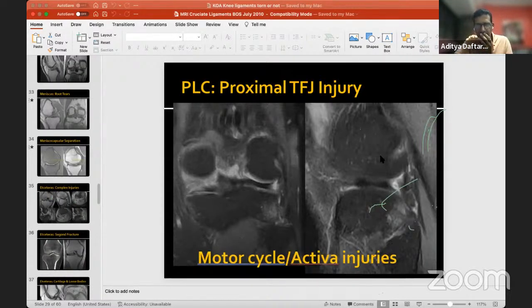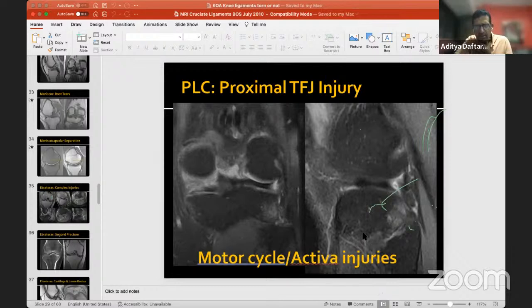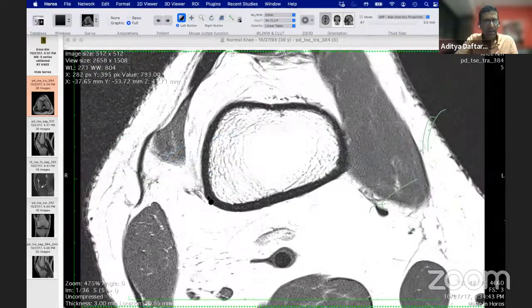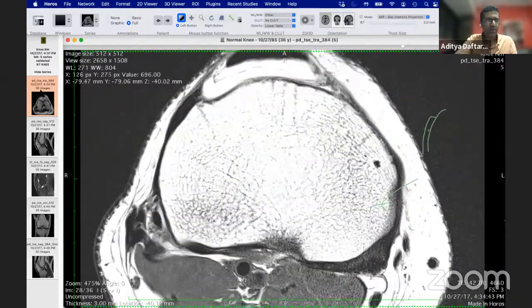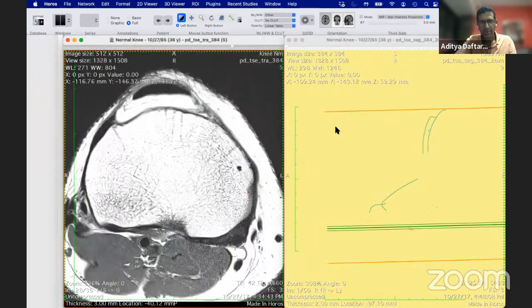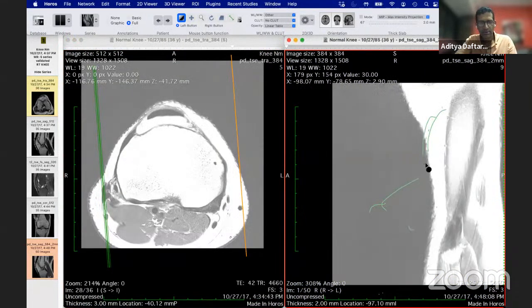Yeah, there will be. I think the next session is only a week later. Sometimes they will differentiate normal PCL and meniscus horizontal tear. I've not really had that be much of an issue. But let me just show you this, since you asked me about it, here's a normal knee MRI. And what I'll just show you is a couple of things that are areas that people can run into issues with.